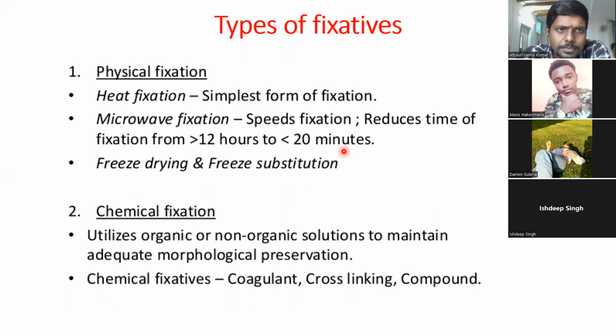Then next one, methods of fixation. As we already discussed, there are two methods of fixation.